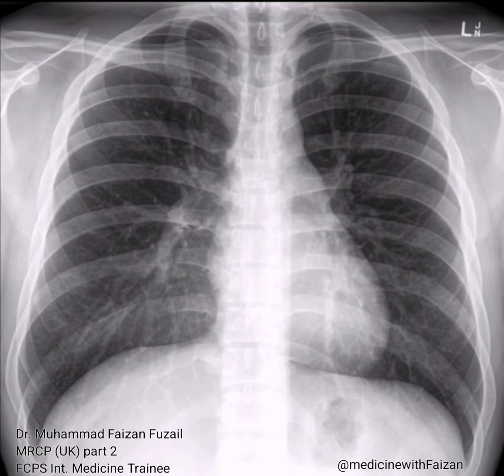For now, we are going to talk only about normal anatomy visible on chest x-rays. Each of these anatomical structures should be viewed using a systematic approach. This is a normal chest x-ray. Pause for a second and see how many anatomical structures can you name.